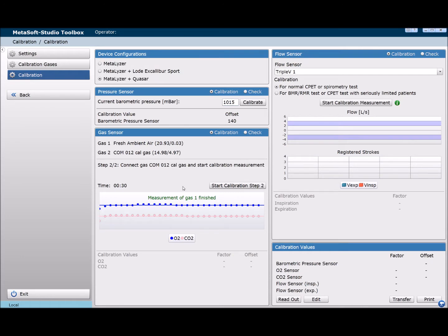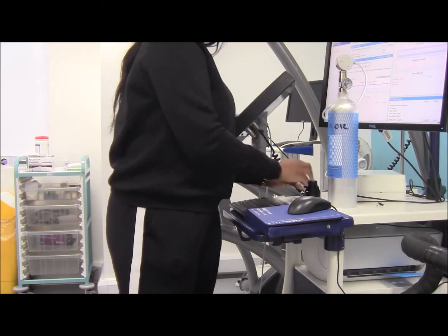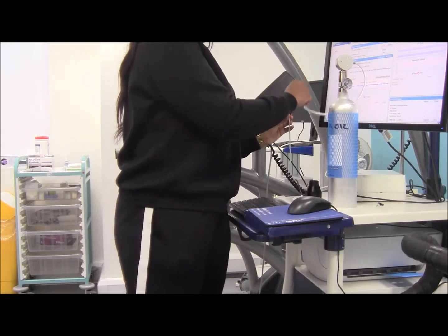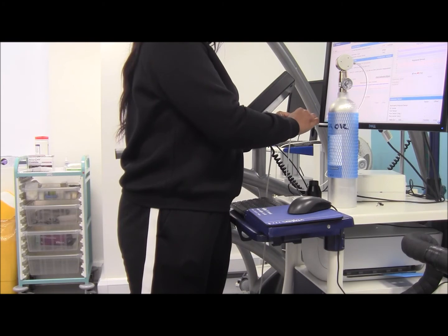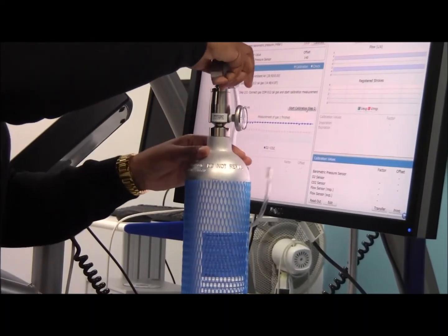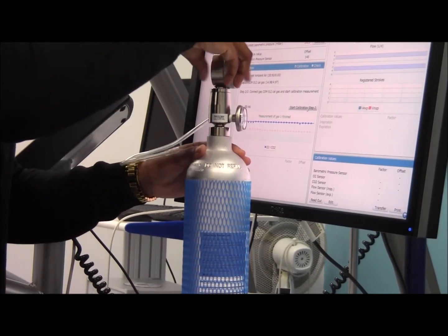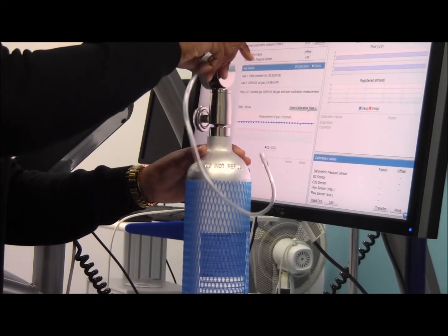Once that is done, place the volume transducer on the side with the sample line connected and click calibration step 1. Ensure the sample line is not exposed to any breathing when this is done, to prevent incorrect interpretation of the ambient air. This should take approximately 40 seconds to complete.